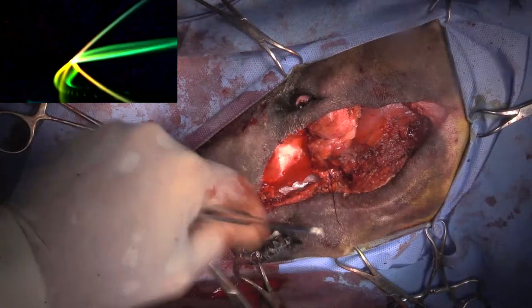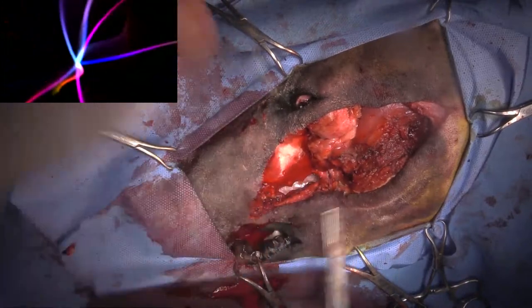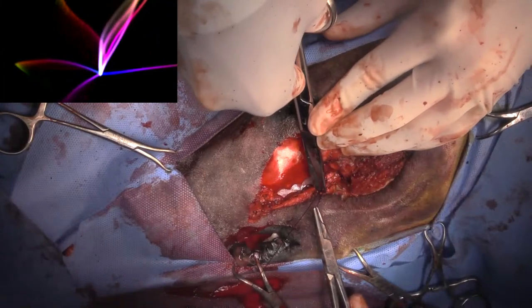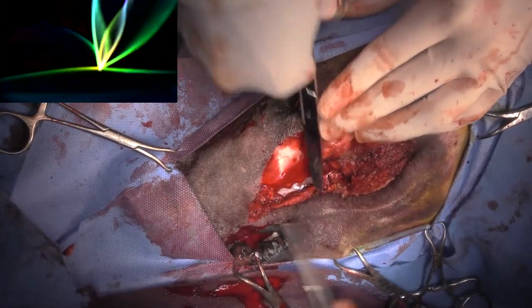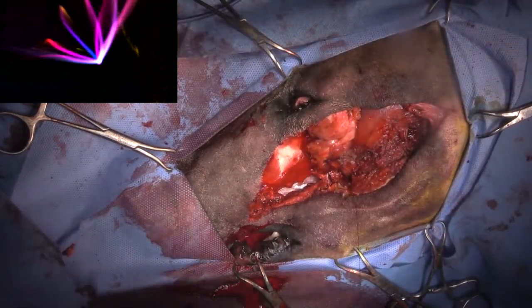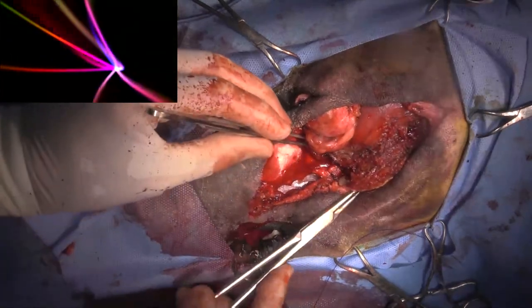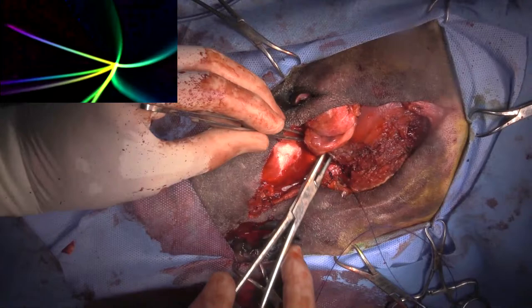So blood pressure dropped a little bit, probably from the blood loss, and then we had given a dose of alfaxan during the surgery. And so we have given a fluid bolus, and we've stopped the blood loss, and the blood pressure is coming up now, so that's good.